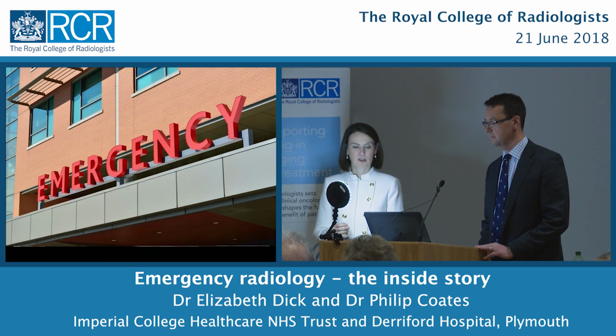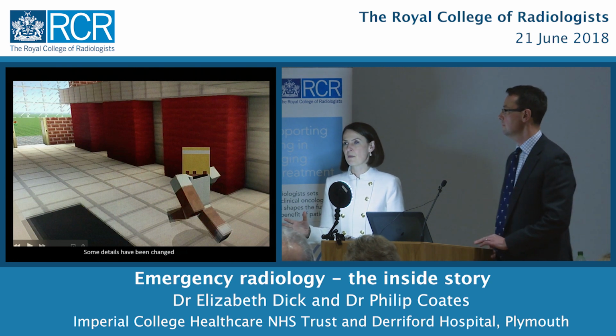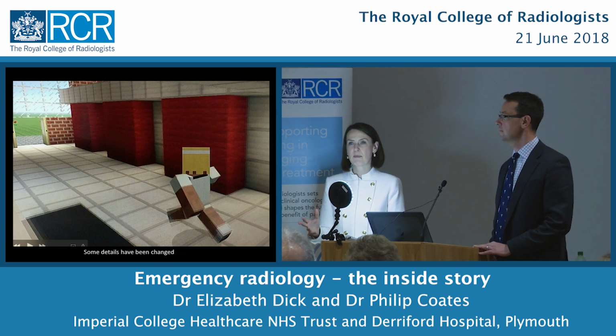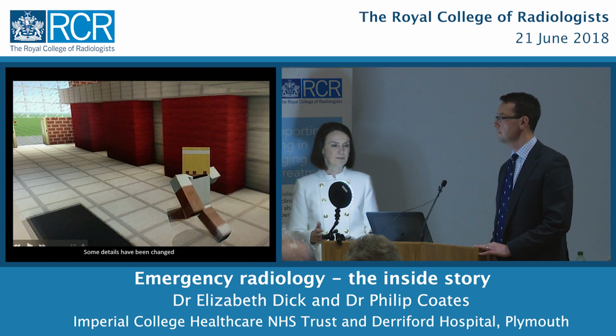Okay, so let's go into the hospital, and just before we start, obviously all of the patients are anonymised, and we've also changed some of the details so that the patients are entirely unidentifiable.